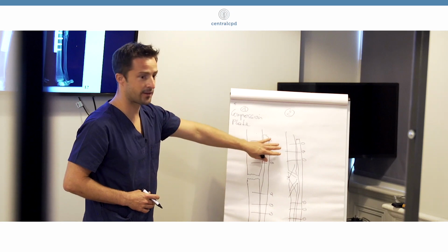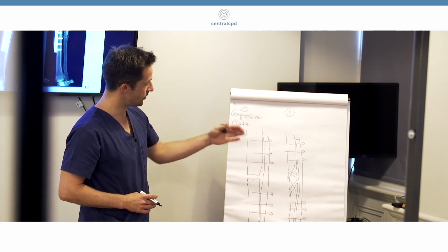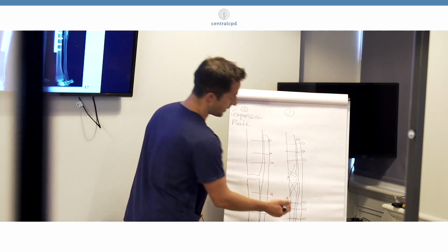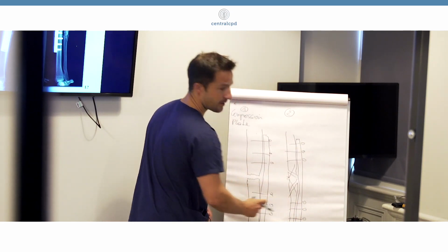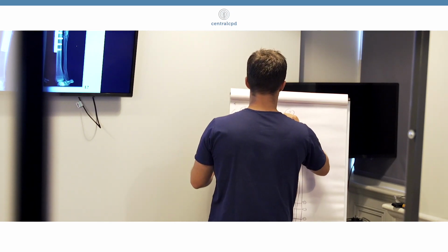Anybody has an idea how this is called then? Neutralization. Exactly. This is a neutralization plate, which means we will not get a compression, but we still have load sharing of the bone and load sharing of the plate. So it's neutralization.